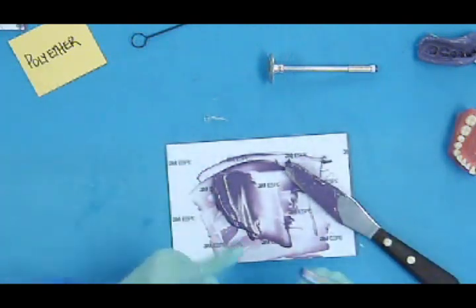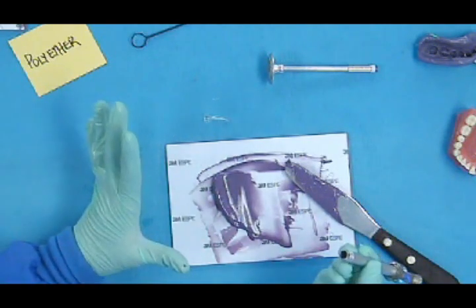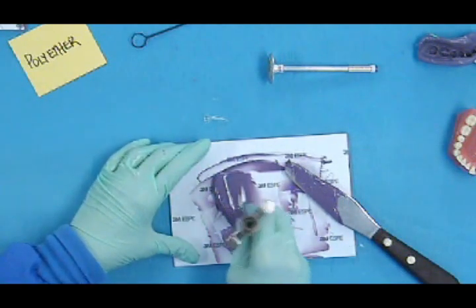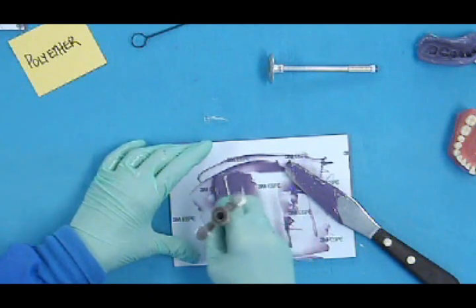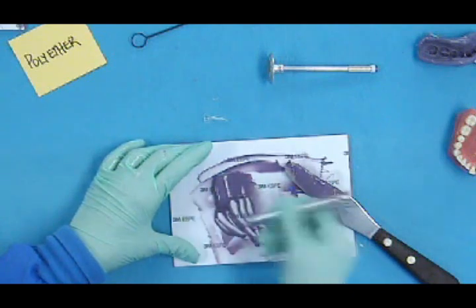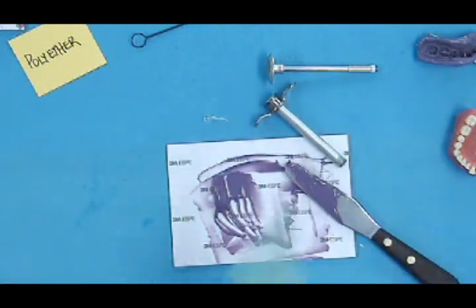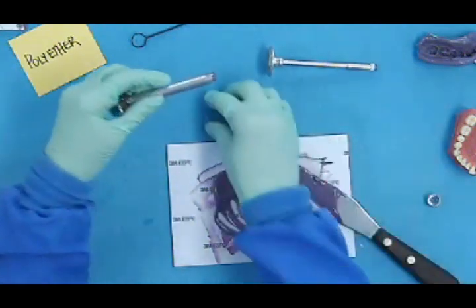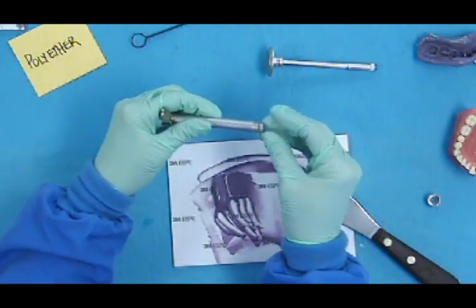This time, I would use this edge of the syringe. And again, I'm going to walk it up. And I'm missing a key component, and I'll open it back in just a second.